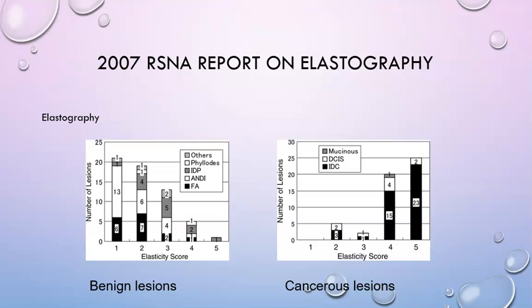So that means when we say that with elastography it is benign, it is negative, that means that 99% of the time when we say that, we are correct. It is actually negative. So that's a huge negative percentage, and it also affords us, with a 99% certainty, we don't have to do a biopsy.